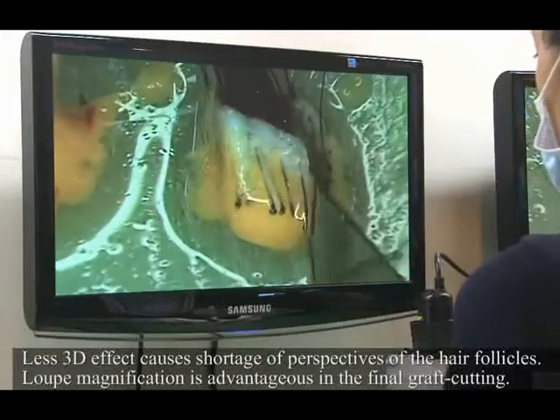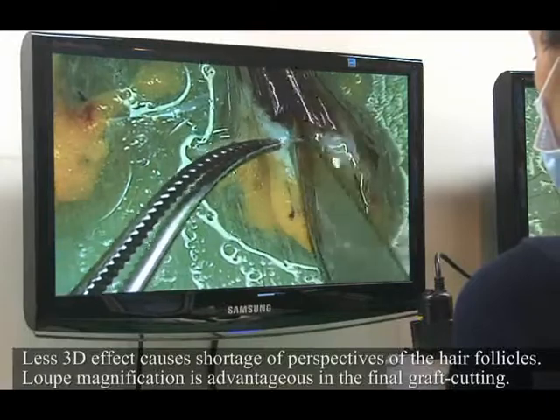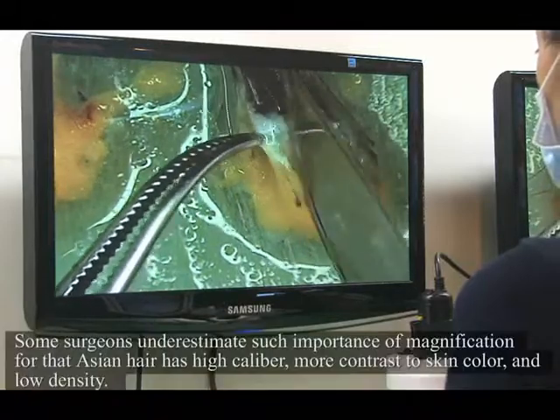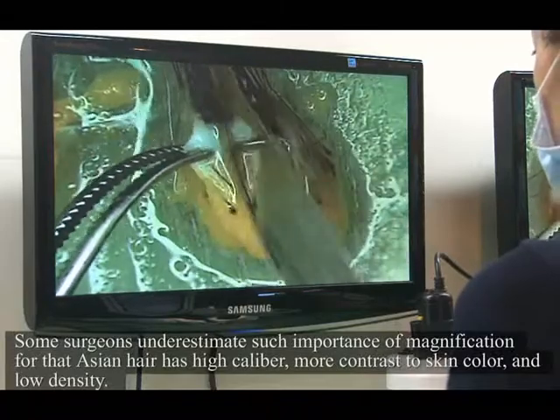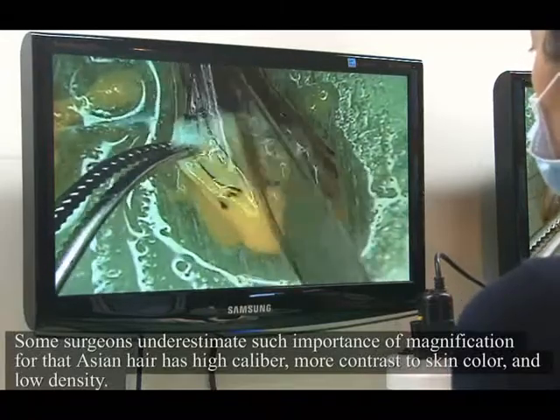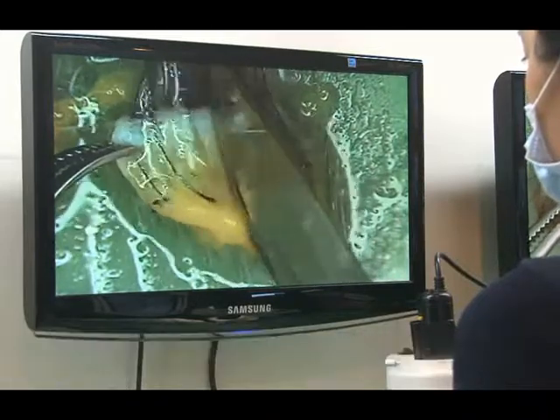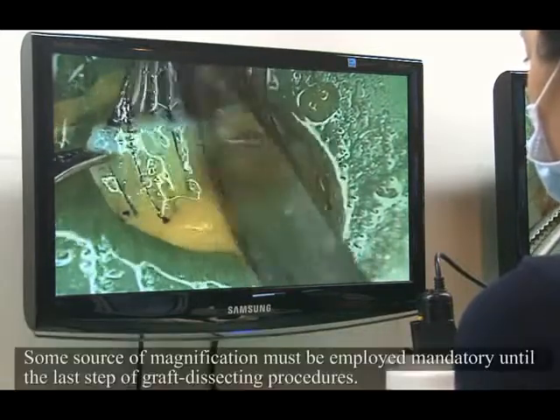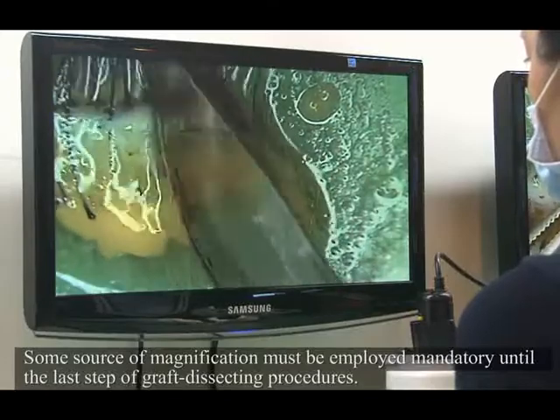Loupe magnification is advantageous in the final graft cutting. Some surgeons underestimate the importance of magnification. For Asian hair has high caliber, more contrasted skin color, and low density. Some sort of magnification must be employed without fail until the last step of the graft dissecting procedure.